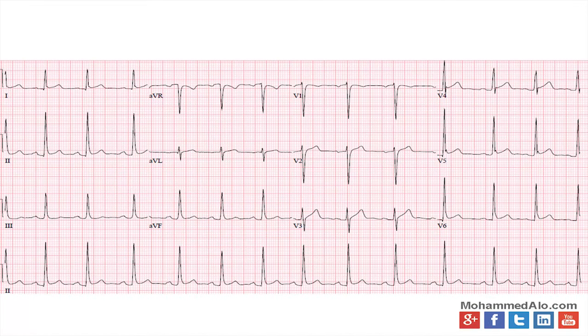Next EKG looks like ST segment elevations kind of everywhere, and you got that notch in V4 and V5. Don't see it as clearly in lead 2. This is your basic early repolarization patient. If you notice how the ST segments don't look like the other ones, and you have a huge tall R wave. When you have an R wave that tall in V4, not an anterior MI, so don't worry about it.